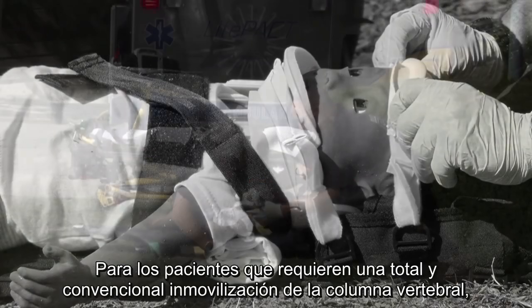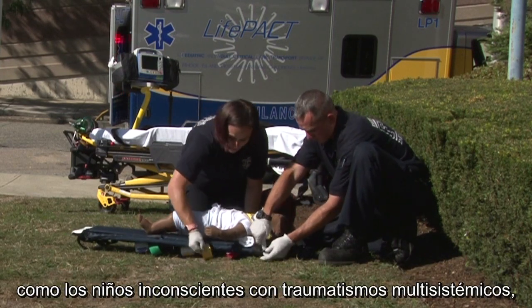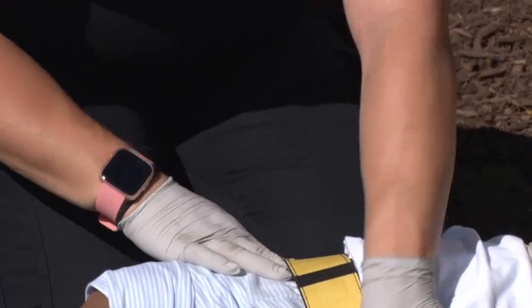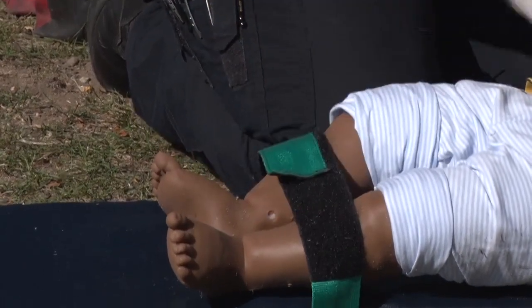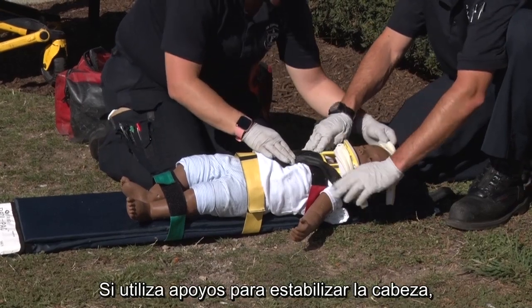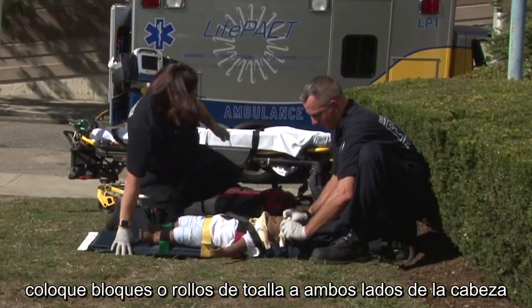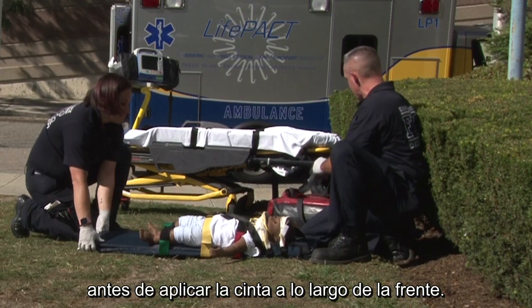For patients who require conventional full spinal immobilization, such as unconscious children with multi-system trauma, apply straps to hold them in place with the body first, legs second, and tape across the forehead last. If you are using props for head stabilization, place blocks or towel rolls on either side of the head prior to the application of the tape across the forehead.